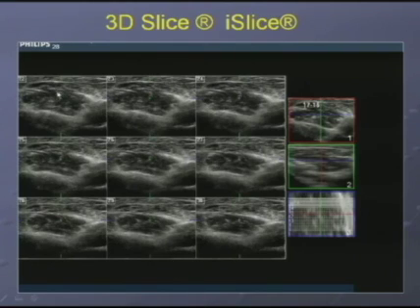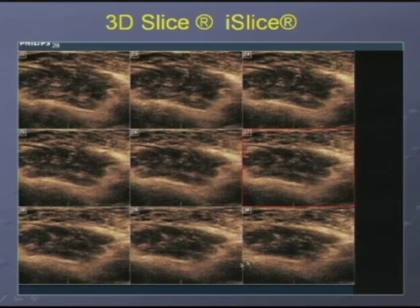With this technique, we can observe a very, very detailed depiction of the borders and the extension of the lesion. And similar to MRI or CT scan, we have these lines here, and we can program the computer in order to show us the image corresponding to each determined line. We can change the color in order to have a better observation for the human eye.